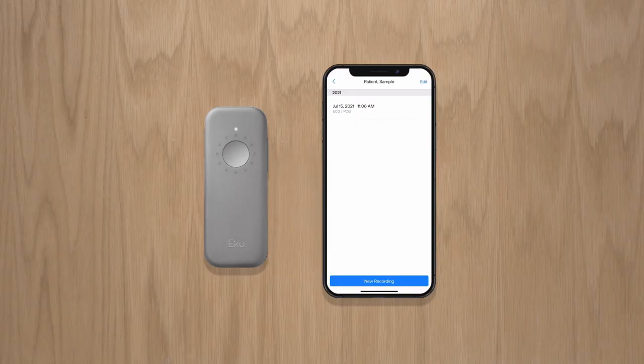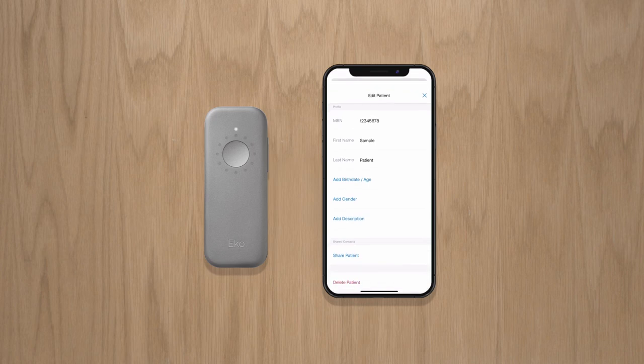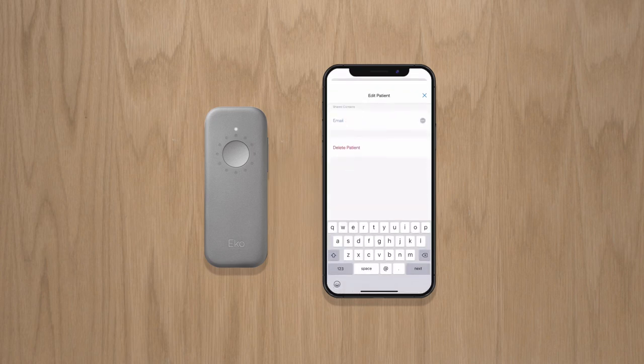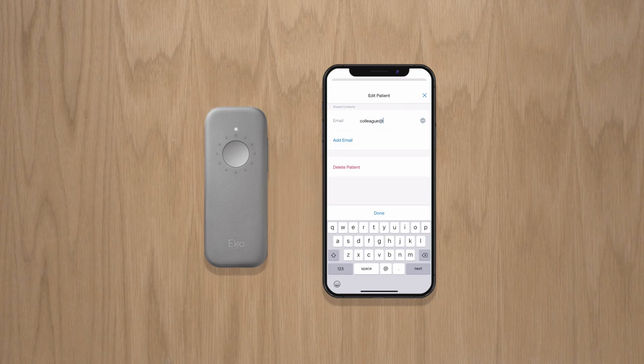To share recordings, go to the patient you wish to share and click Edit in the upper right. Scroll down to Shared Contacts. Enter the recipient's email and a link will be sent with directions to create a free Echo account and securely view the data.